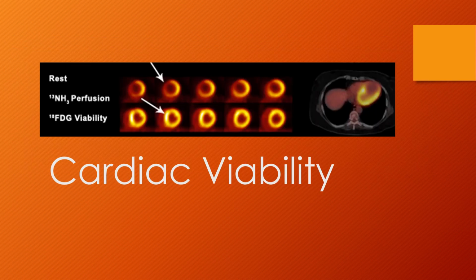Now, we will cover cardiac viability in another video, another lecture, but I do want to talk to you just a little bit about cardiac viability because some protocols and some facilities will do a cardiac viability immediately following the MPI study. Some of them have them come back another day, but some of them it's part of the protocol. So on certain patients, if they know they order it, they can do it the same day, or they do a stress test with it when they want a viability. So I just want to discuss that a little bit with you.